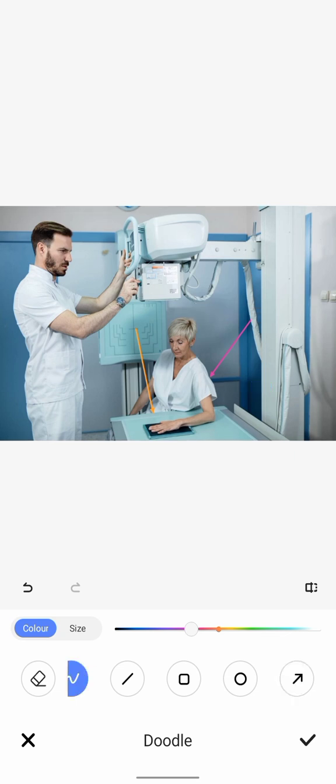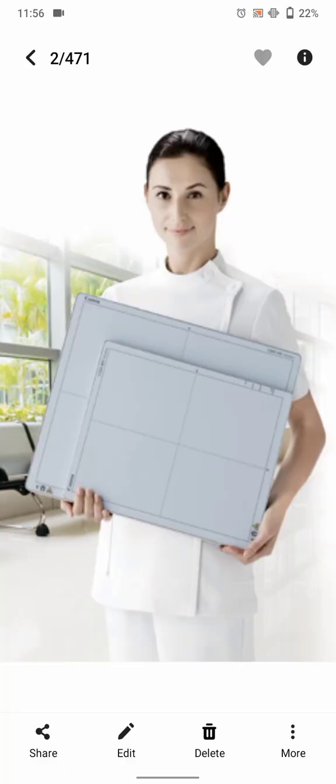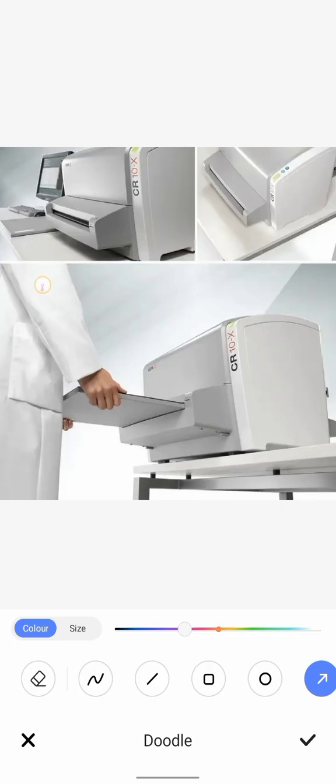When we press the exposure button, the x-rays come out, go directly through, take the information of the patient's body and paste it on the cassette. Inside the cassette there is an imaging plate. After exposure to the x-rays, we take the cassette and put it inside the image reader. This is an image reader, and a technician or technologist puts this cassette inside the image reader.